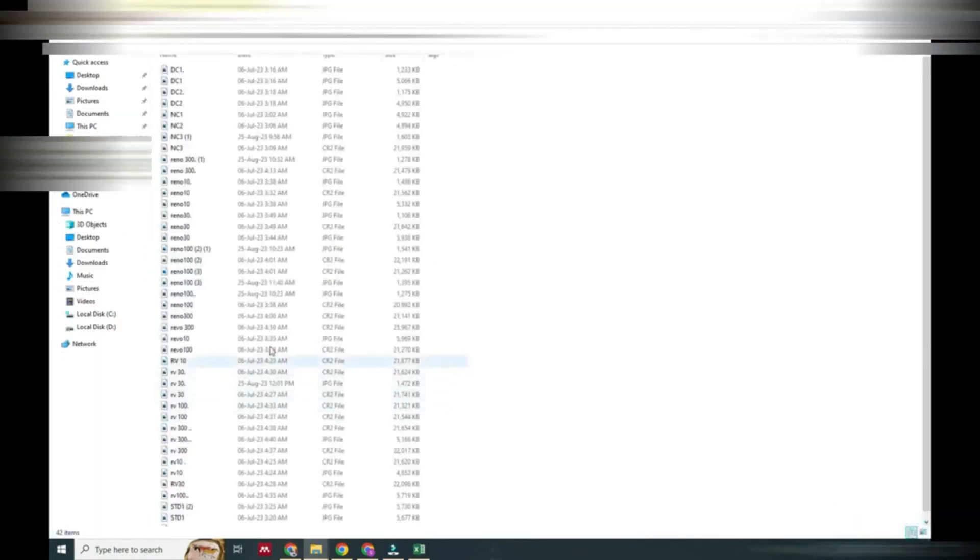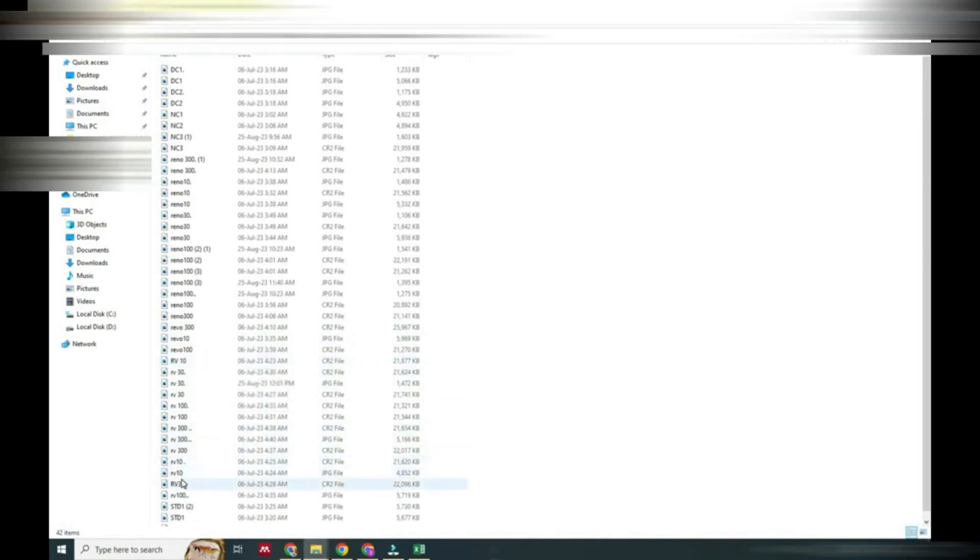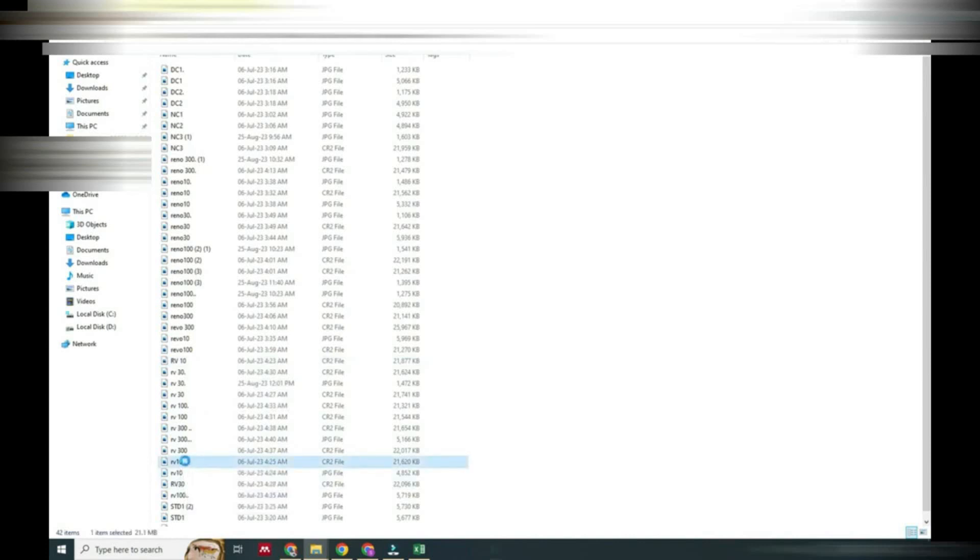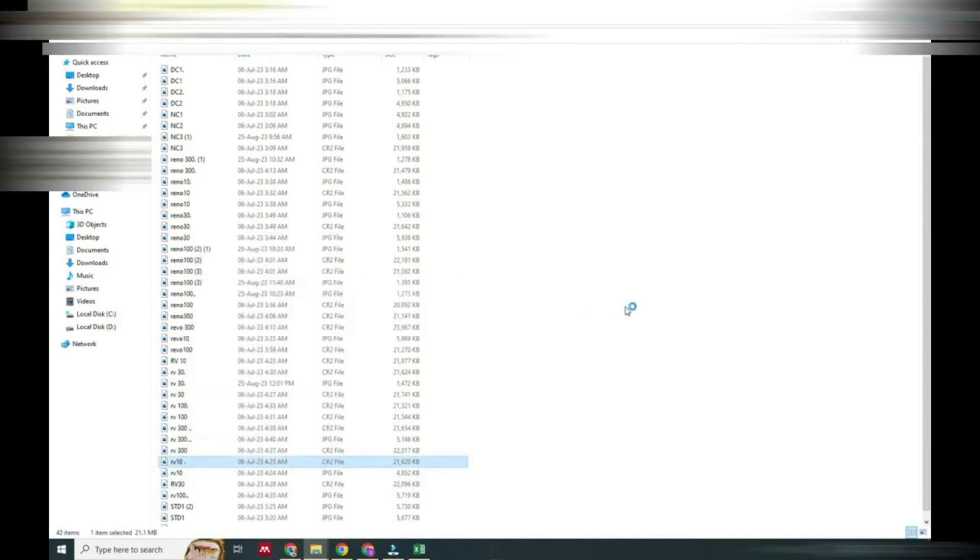We will select one image in CR2 format. That CR2 file we will open in the Photos option. Now you can see it is opening.